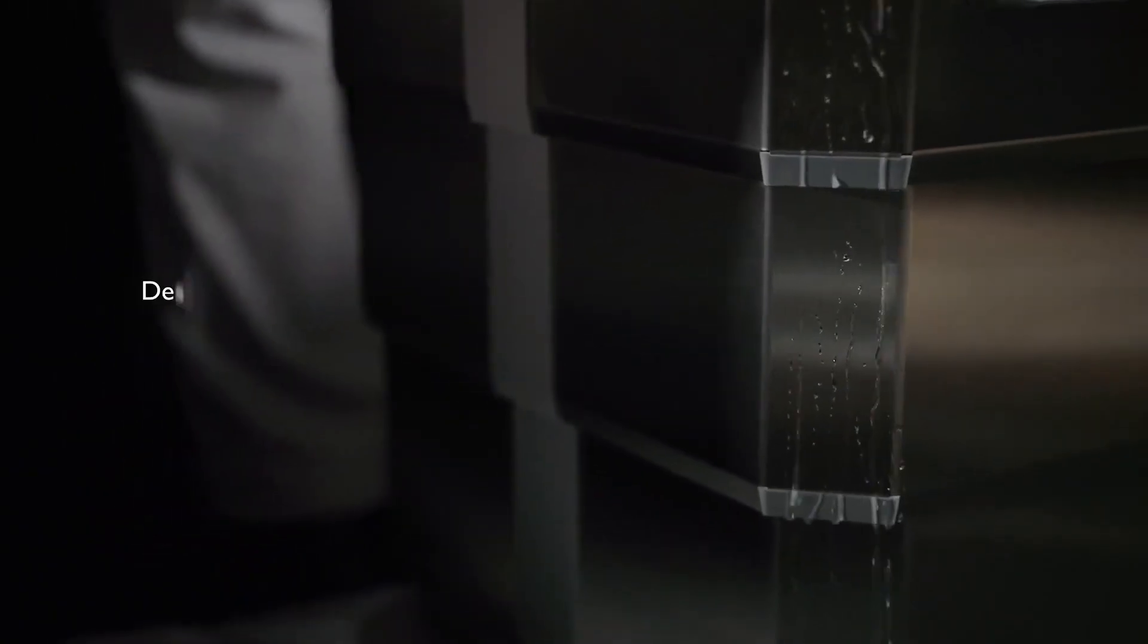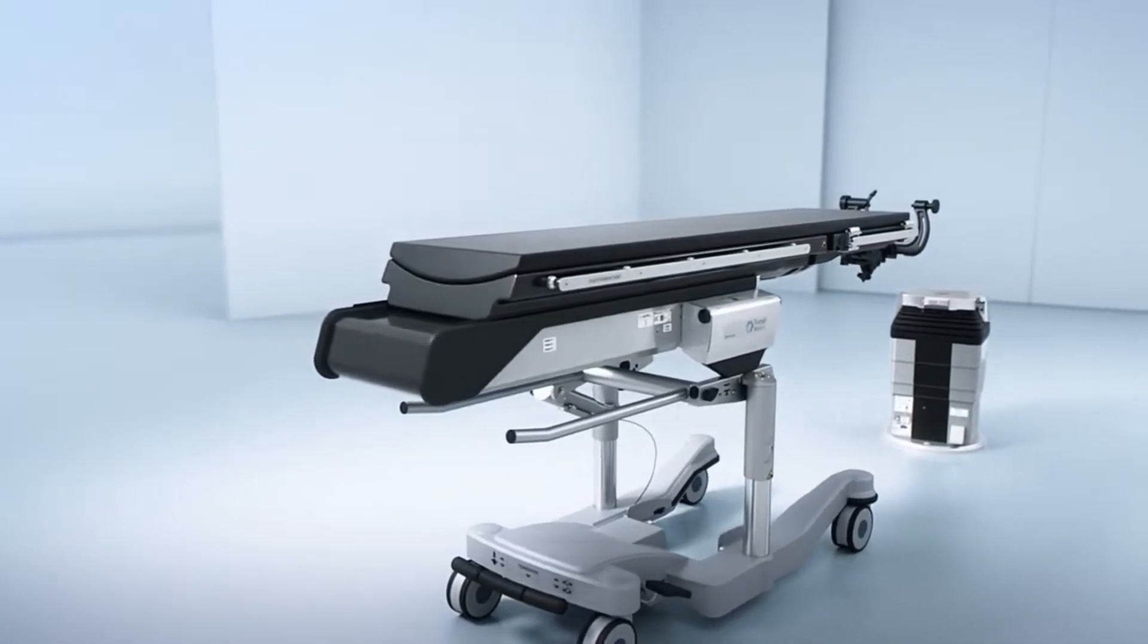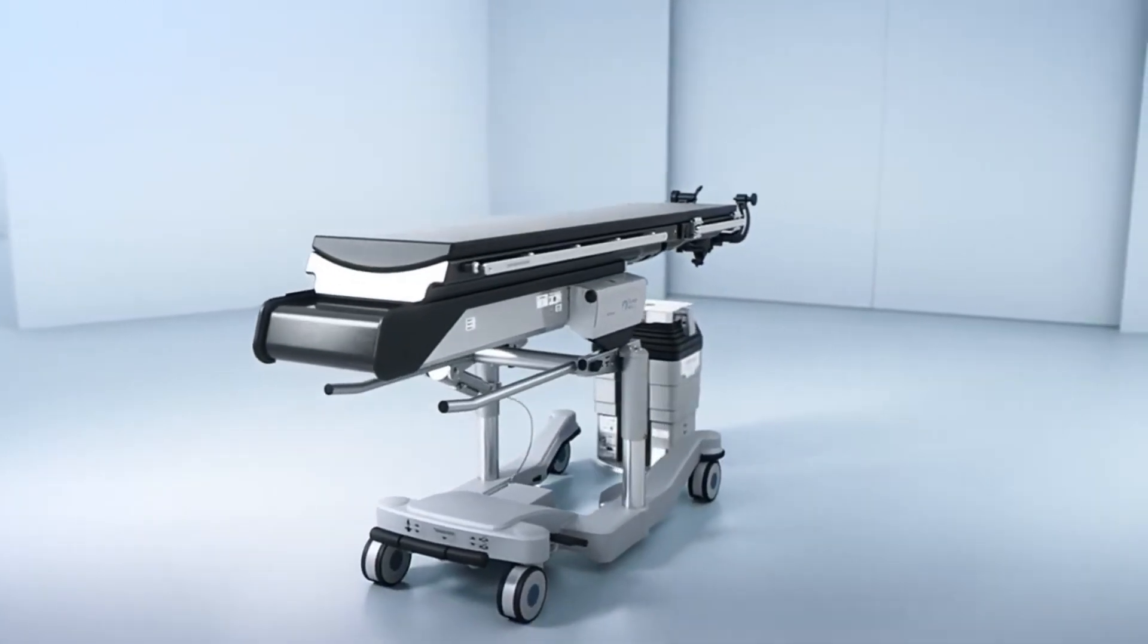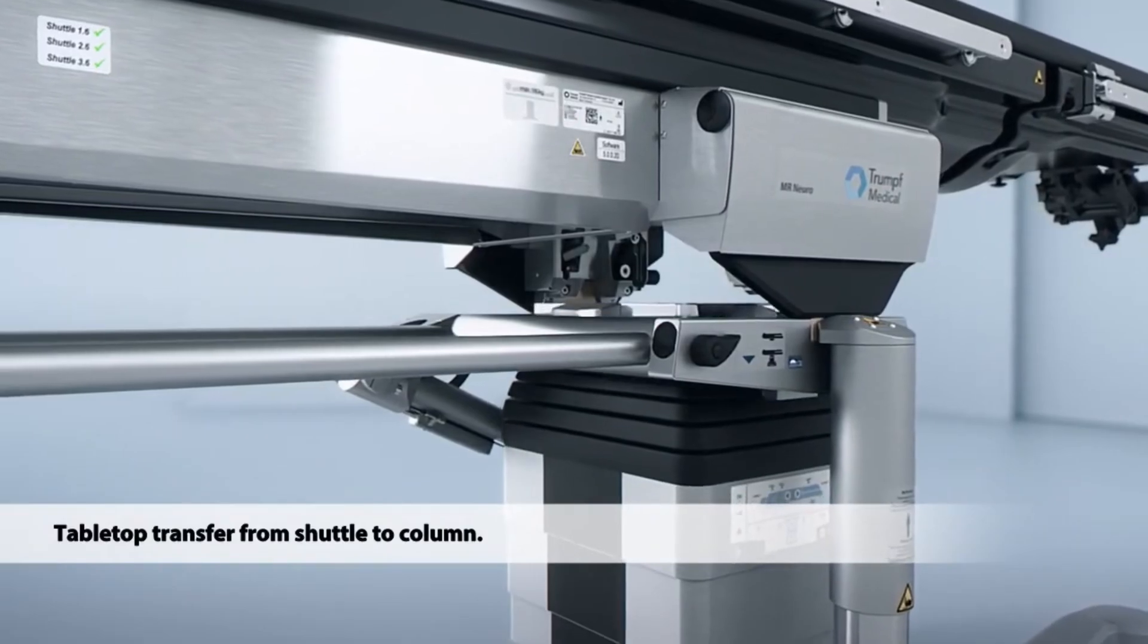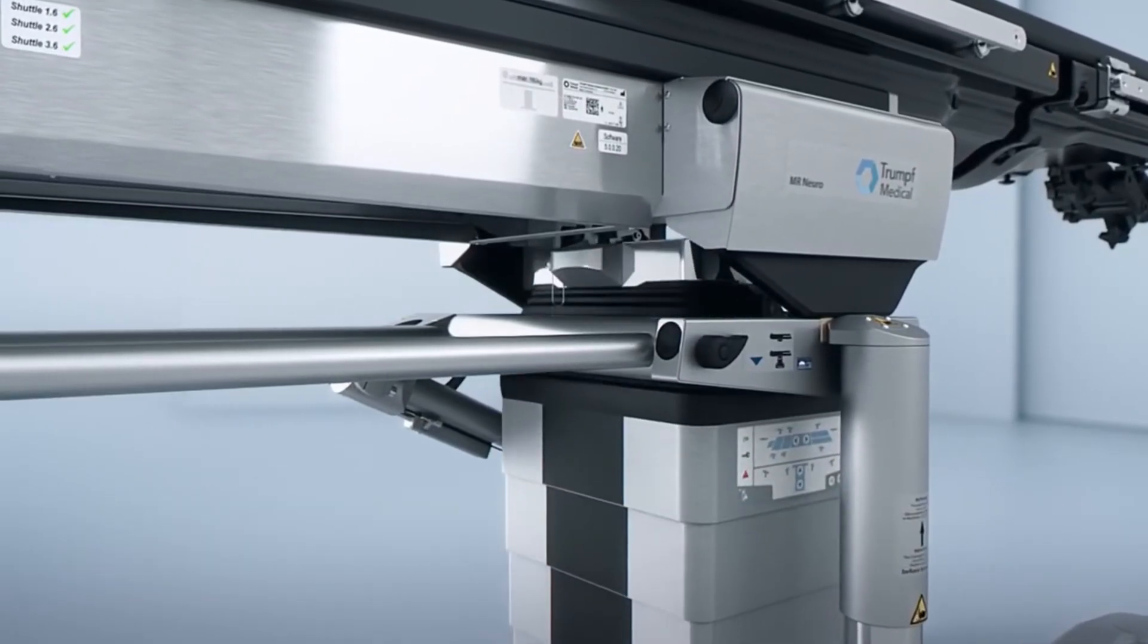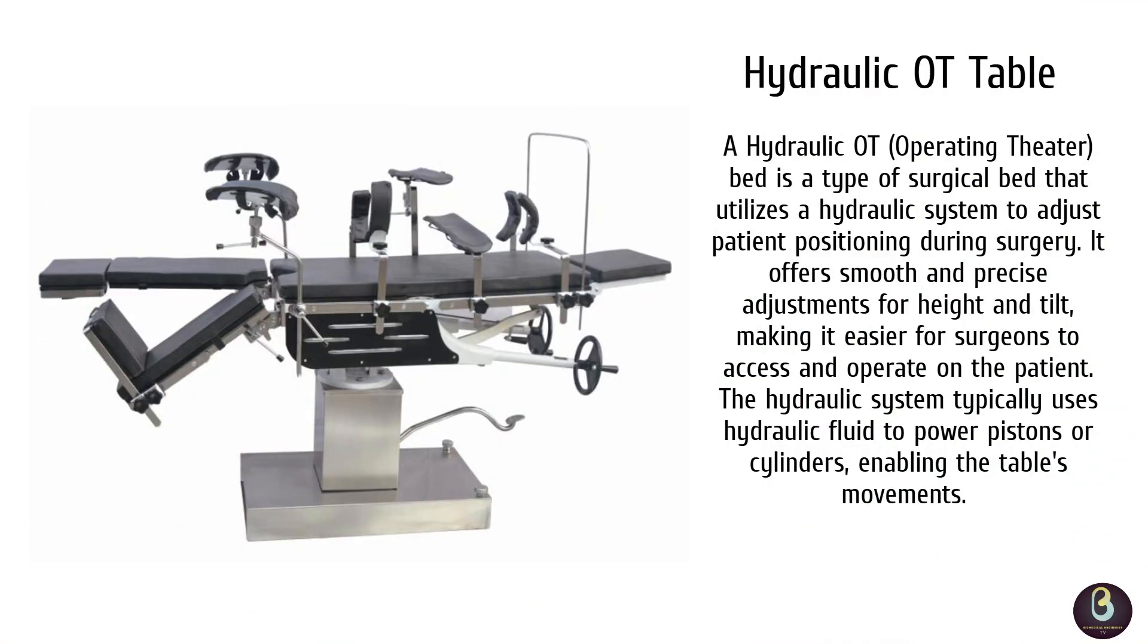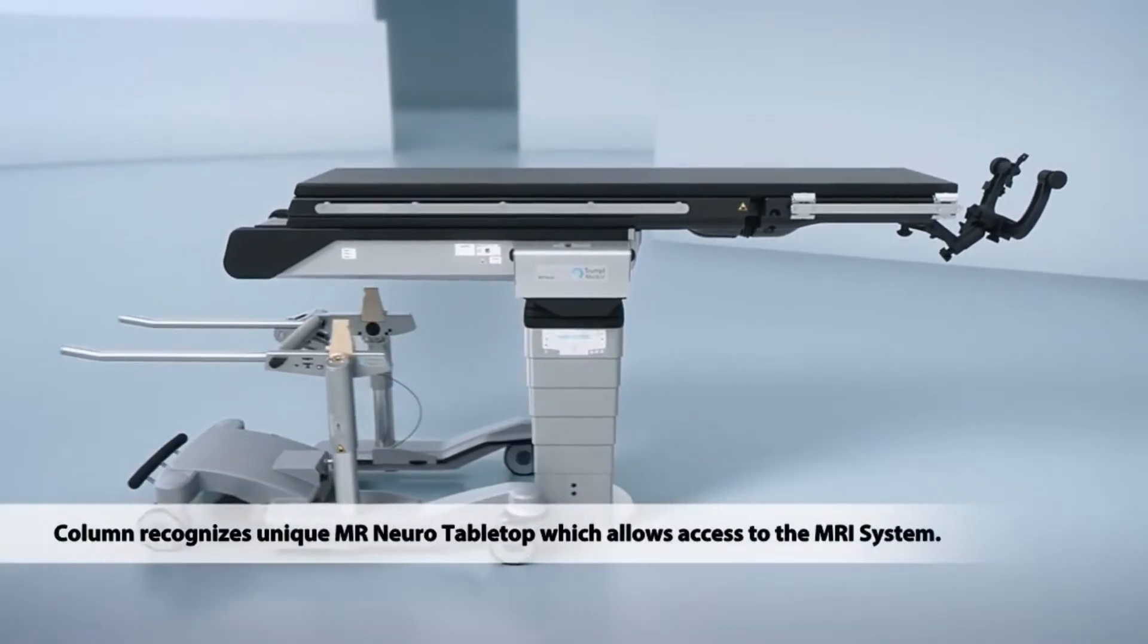The third is the hydraulic OT bed. We have the hydraulic OT bed. These beds use a hydraulic system to adjust the bed's height and position. Though it doesn't have as many electronic controls as the electric bed, it's highly durable and often used in more rugged settings or where electrical power might be unreliable.